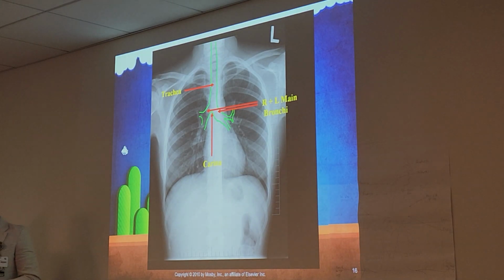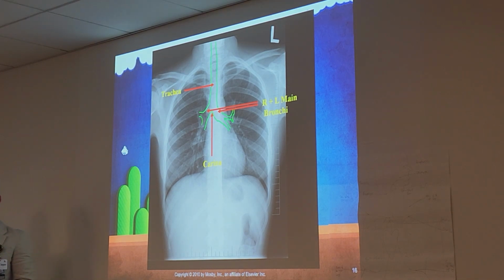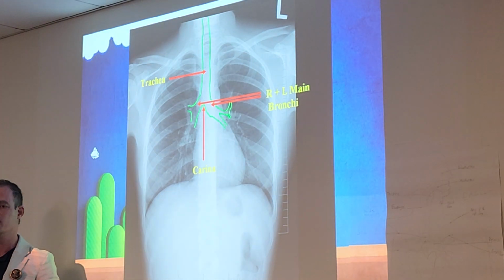Okay. And of course, x-rays, guys, don't forget your hot spots. Just a few things to review. Remember, we can't really see the bronchi too well on an x-ray. We basically just see the little branches that we call what? Hilar region. You remember that? Hilar region. But sometimes, depending on how much air the patient has breathed in during the x-ray, we can make out the bifurcation area of the carina, which is always in that exact spot you see labeled there. Of course, if we see air in the trachea, we're going to label that as the air-filled trachea. We can see that as well.